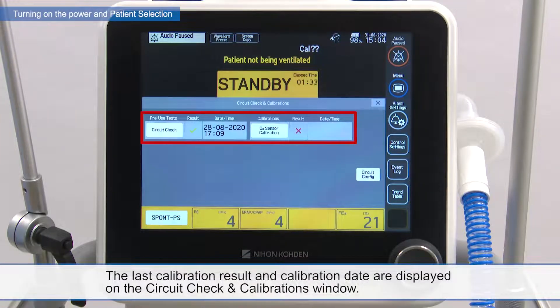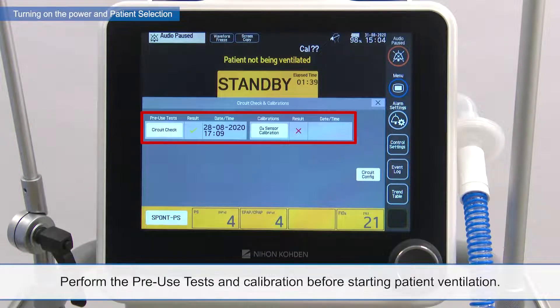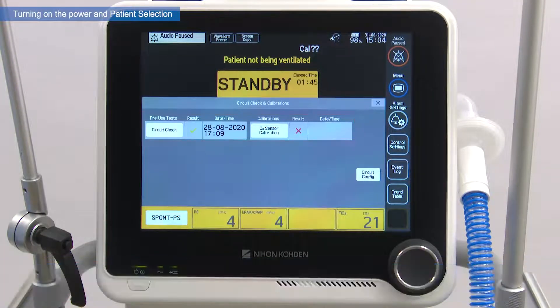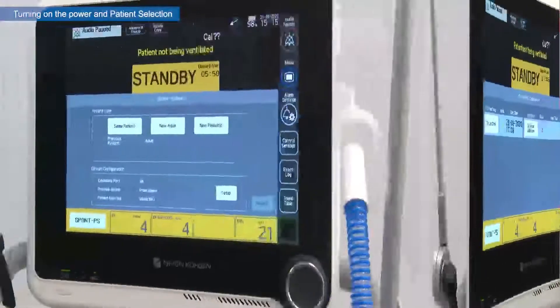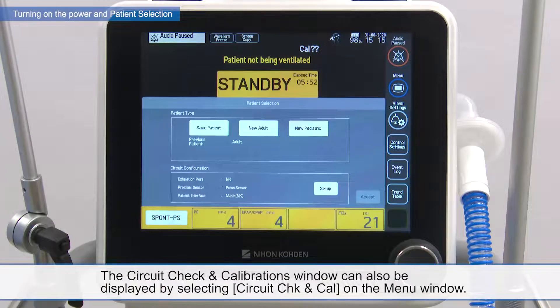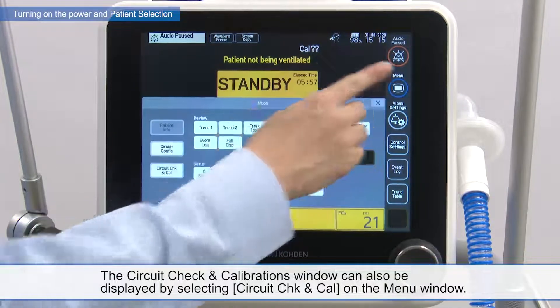The circuit check and calibrations window displays the last calibration result and calibration date. Perform the pre-use tests and calibration before starting patient ventilation. The circuit check and calibrations window can also be displayed by selecting circuit check and cal on the menu window.